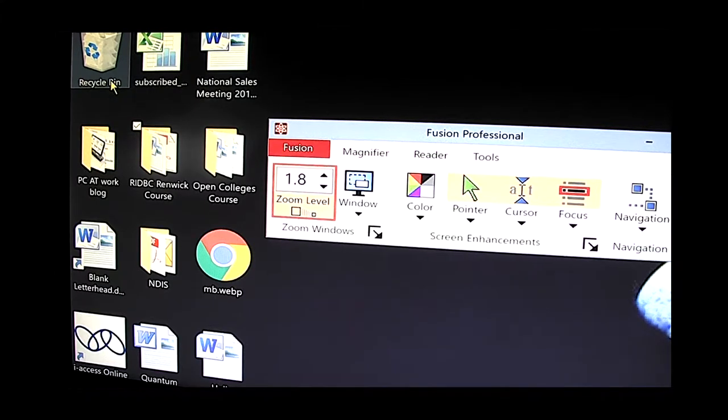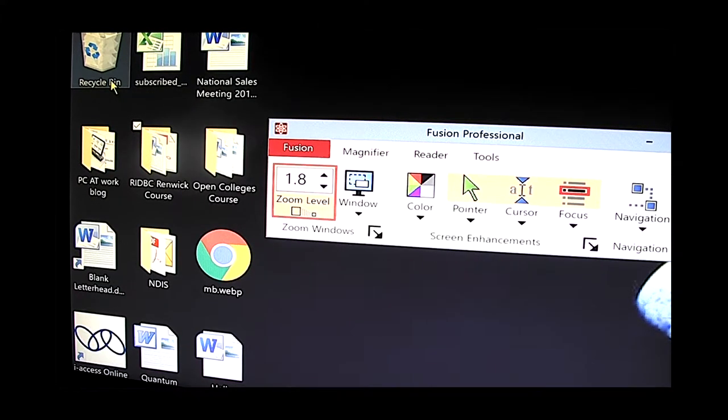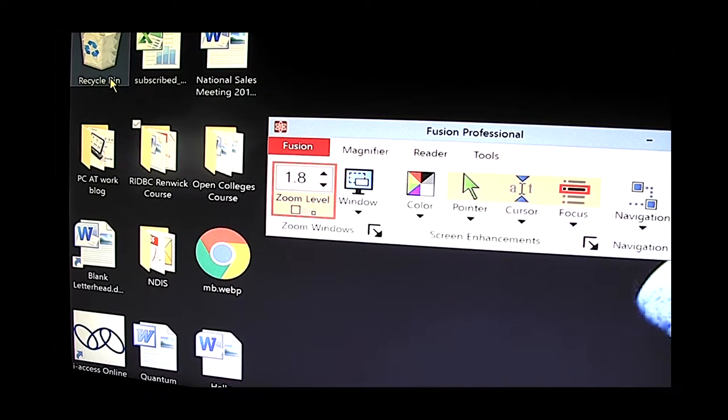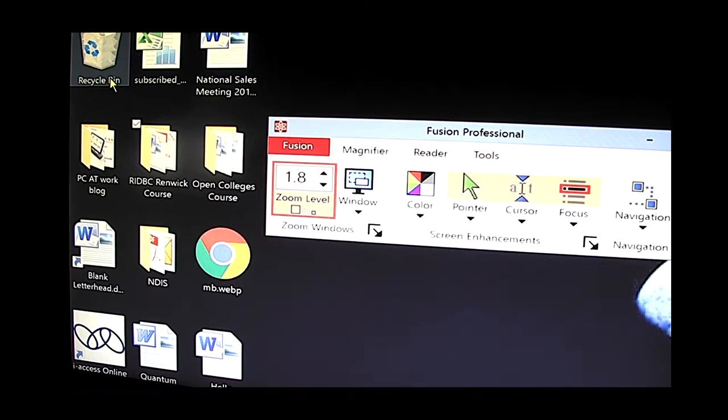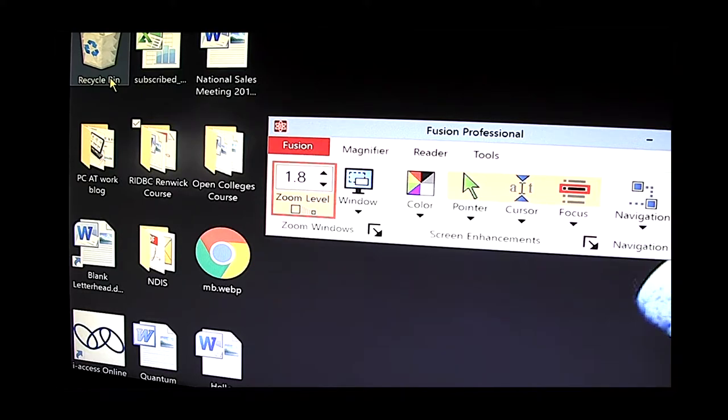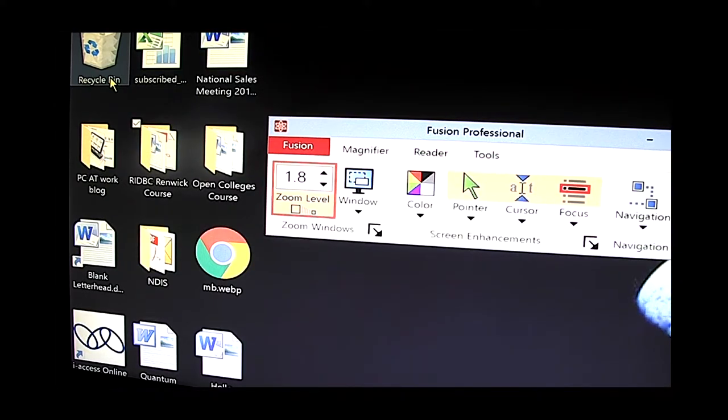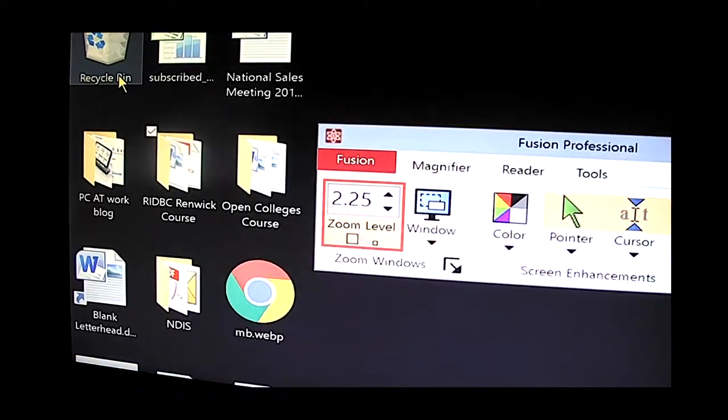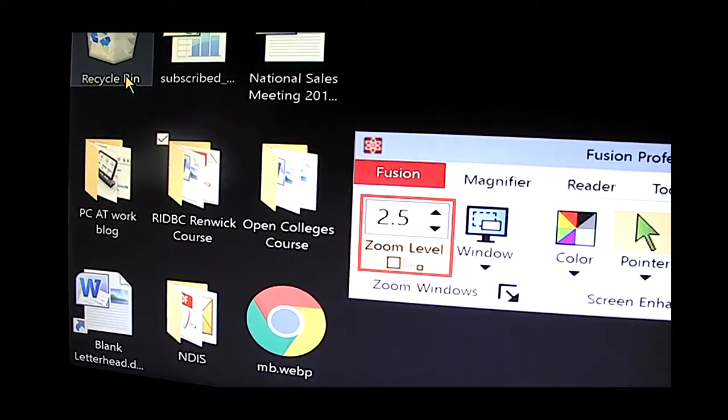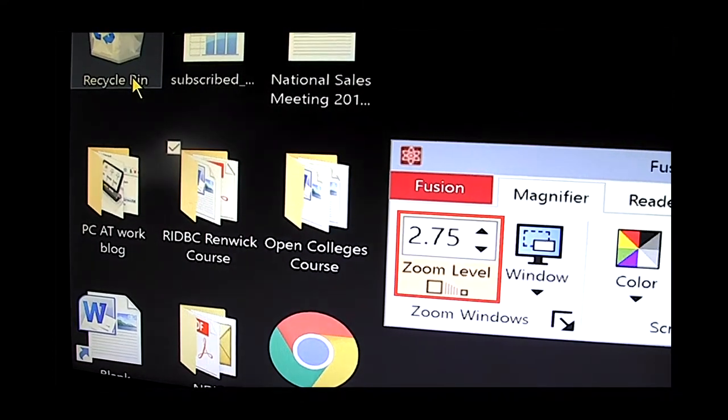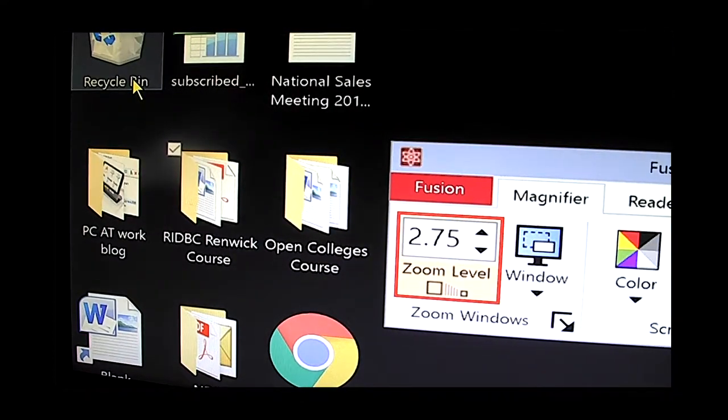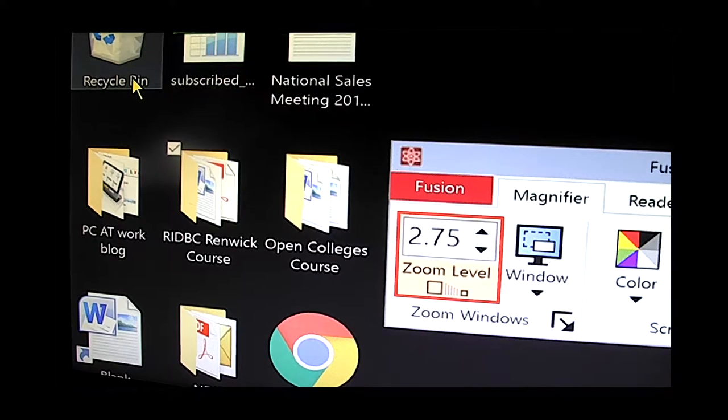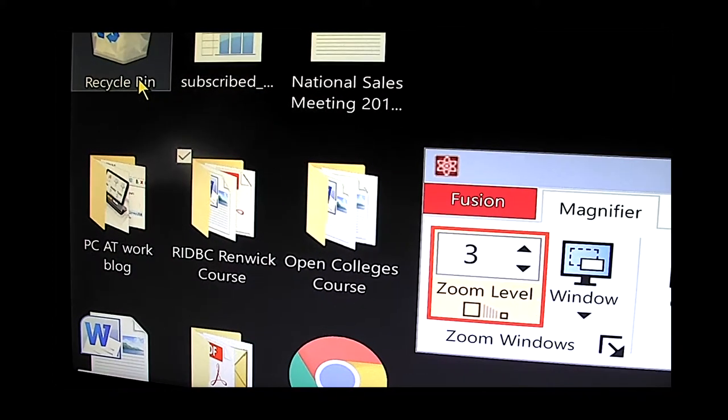But the screen is now magnified 1.8 times and we can of course go larger than that. I'm actually going to use the keyboard to do this now rather than the mouse. I'm going to press the caps lock key with the up arrow. Caps lock is the ZoomText key and the up arrow is to indicate that we're increasing the magnification. 2, 2.25, 2.5, 2.75.